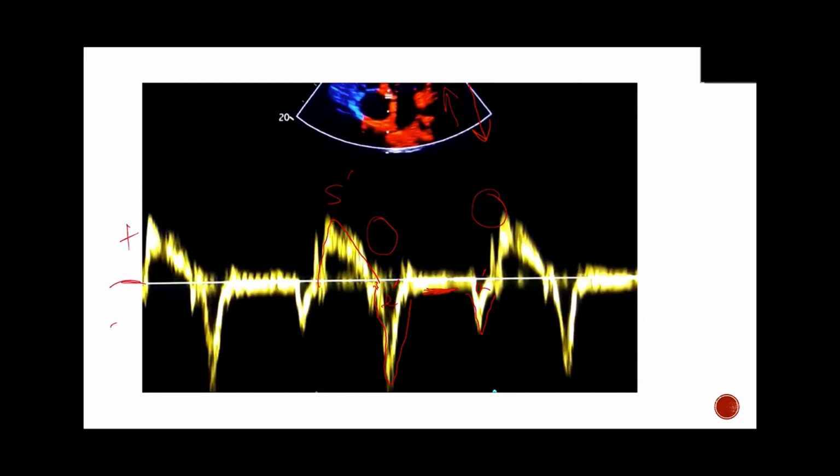Whereas in patients who have diastolic dysfunction, that tissue is going to move relatively consistently. Now, we spoke earlier about young healthy patients. Because young healthy patients are able to have an active untwisting and relaxation of the ventricle, so it's more of an active process, they can actually have their tissue Doppler increase as well with higher preloads.